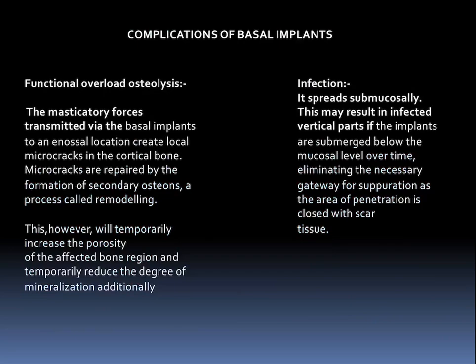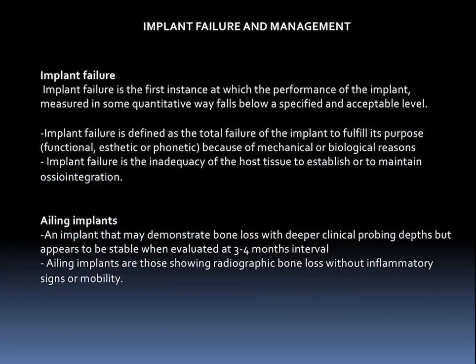Also, the chances of infection from the secondary side are very much possible in case of basal implants.